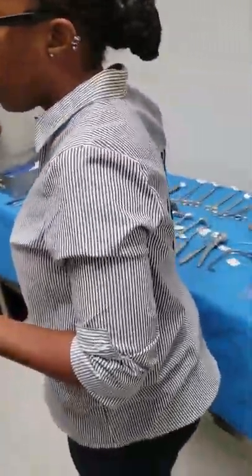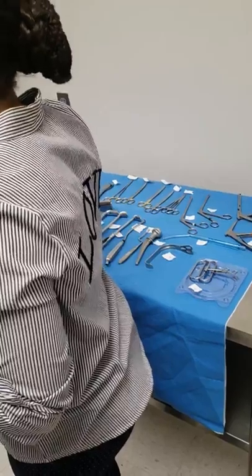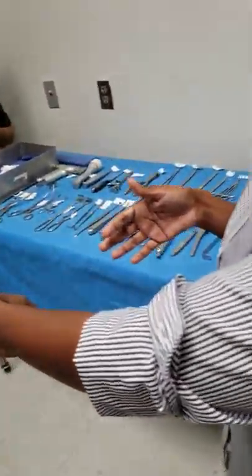I'm going to put my gown and glove on my what? On your mayo stand. I'm going to put my back table cover where? On the back table. And any supplies that I'm going to open in my ring stand, it's going to be over here by me. Bring the ring stand over here. We'll open it in here.